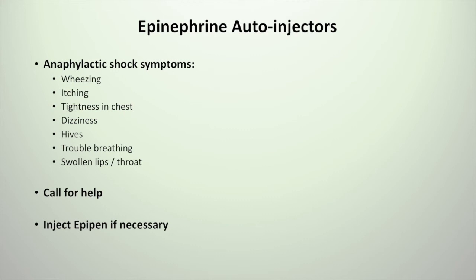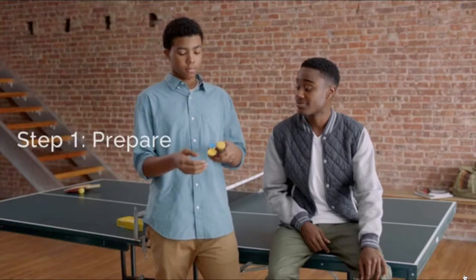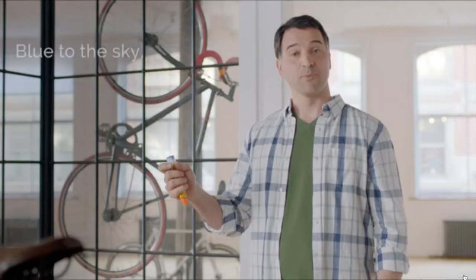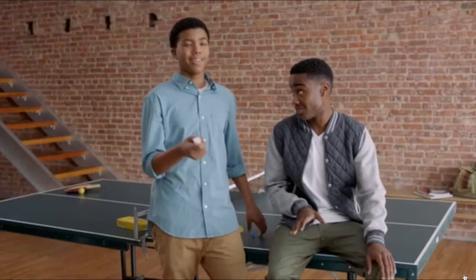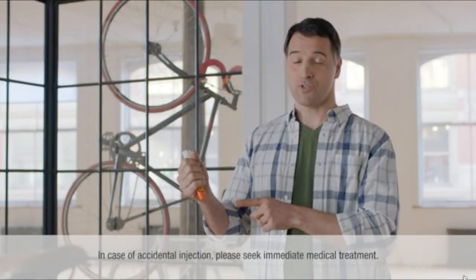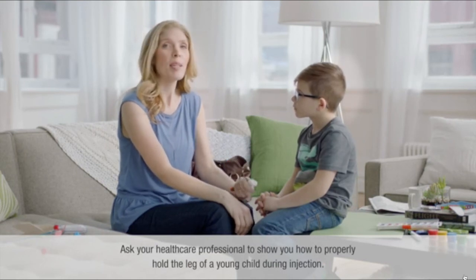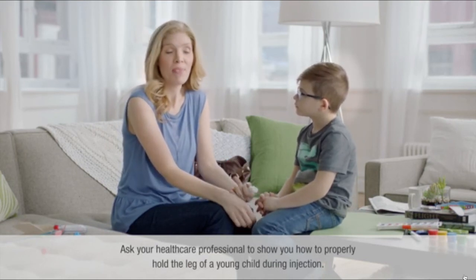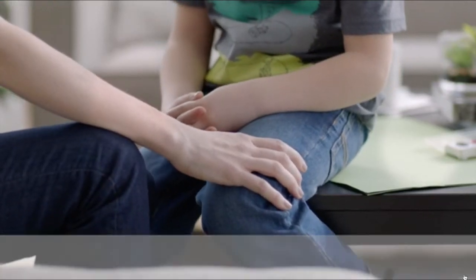Here's a video to review on how to use the EpiPen. Whether you need to use the EpiPen on yourself or give it to someone else, you can just follow these simple steps. First, take it out of the tube — flip open the yellow or green cap, slide it out, and hold it like this: blue to the sky, orange to the thigh. Remove the blue safety cap. Never put your hands near the orange tip because that's where the needle comes out. The needle is designed to go through clothing, including jeans, because it must be injected into the outer thigh for quick absorption. If you're helping a young child, hold the leg firmly in place.